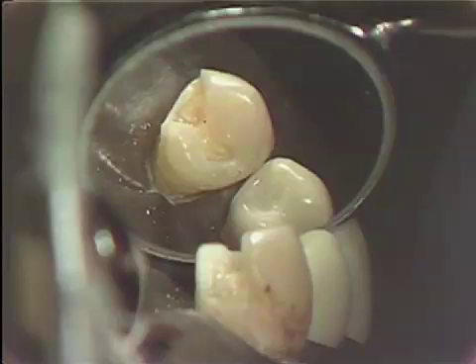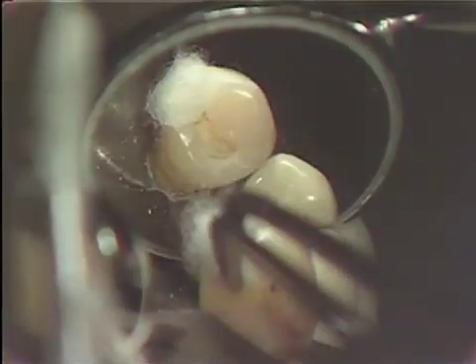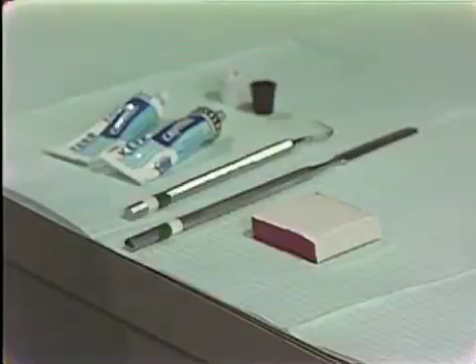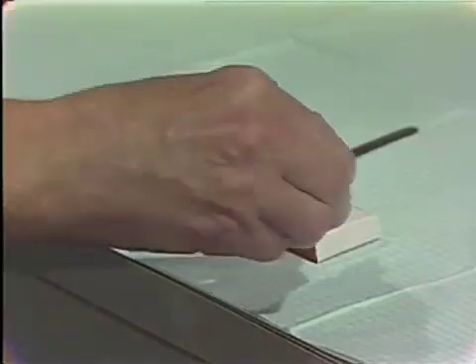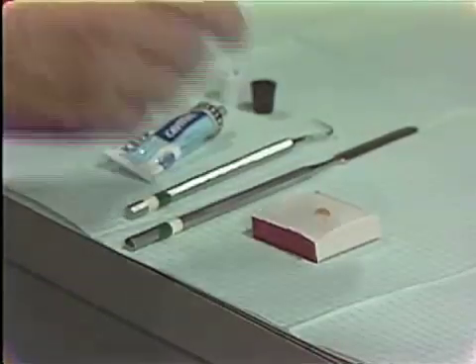First we will take tap water and wipe out the debris from the cavity. This will be followed with dry cotton. Note we are not blowing any air into this preparation. Due to its depth, we will place the zinc oxide base into the deepened area.